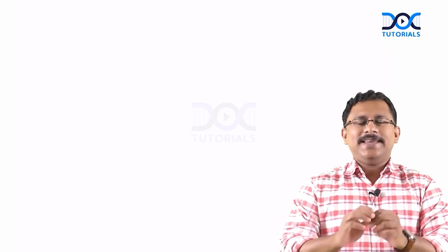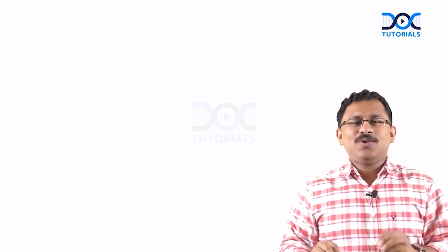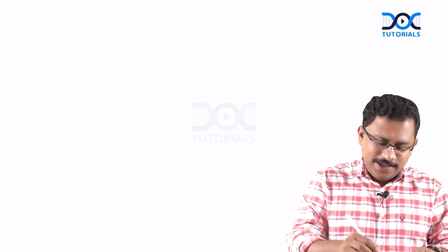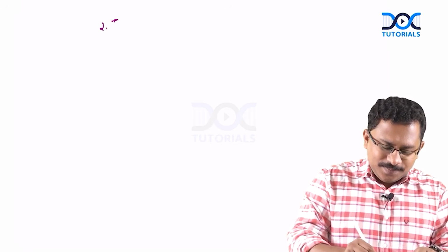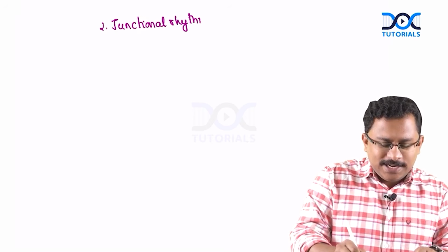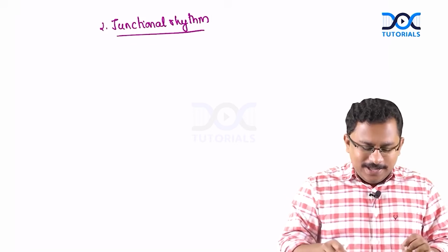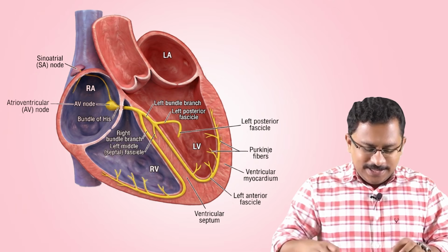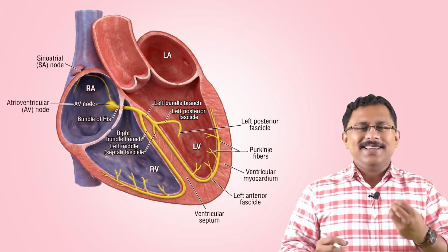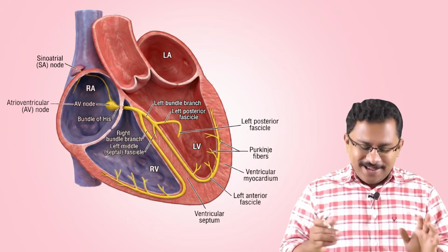So after the sinus rhythm, next we are going to discuss junctional rhythm. Now what is this junctional rhythm? Well, when you take the conducting system of the heart, what lies at the junction of the atria and ventricles?